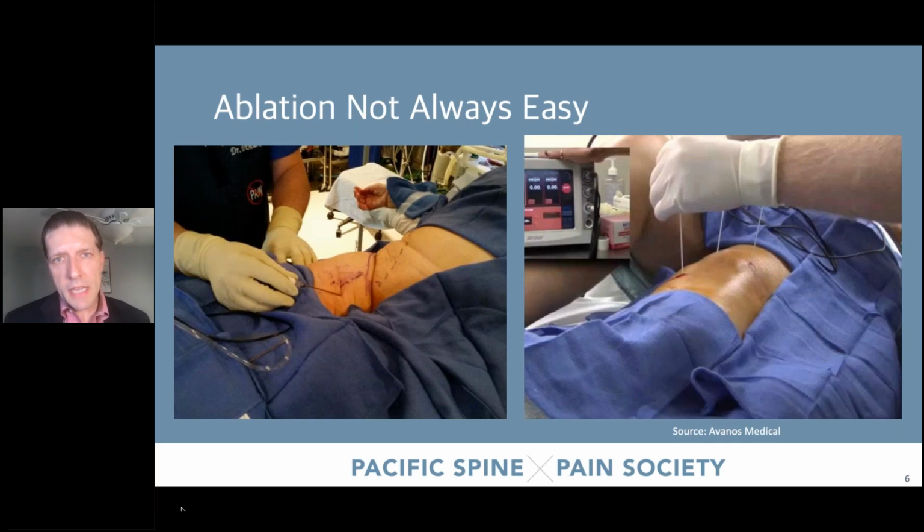I will comment on the hip, because that certainly, of all of the ablation techniques that I will discuss, involves deeper placement of needles. And so BMI consideration, positioning are all factors. These are also factors for the knee, for example, as well, but are worth noting ahead of time, and sometimes require good planning on the part of the practitioner on how you're going to proceed with the patient. Next slide.